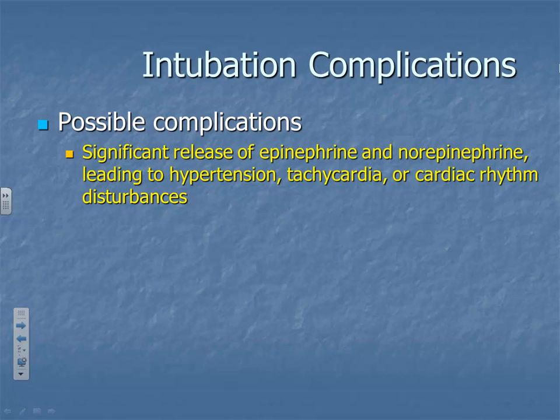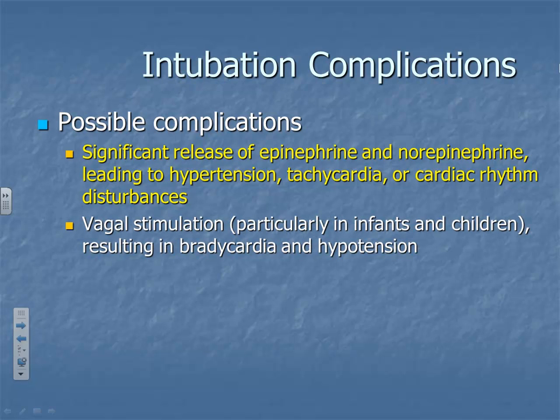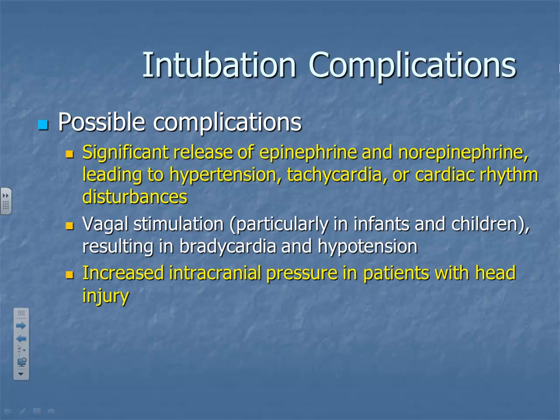So be real careful and try to keep that tube off of anywhere the back of the throat. It doesn't touch anything except those vocal cords when you're going through. So that whole jam it till you get it approach doesn't cut it. Vagal stimulation, I just mentioned that. It's not good for kids. It can cause an increase in intracranial pressure if you've got a patient with a head injury.